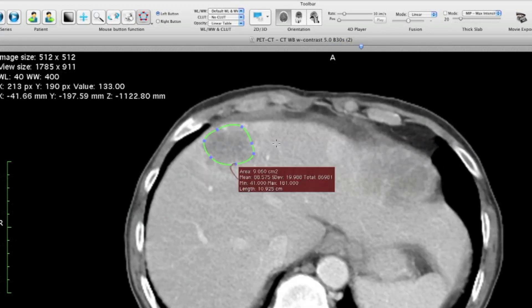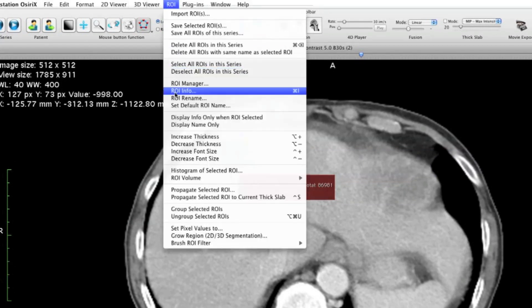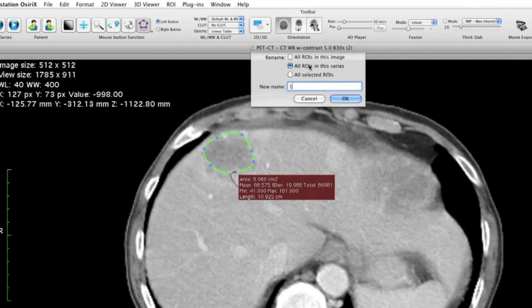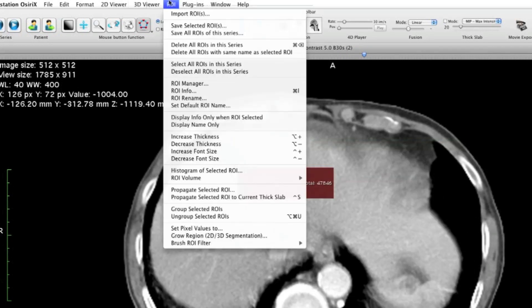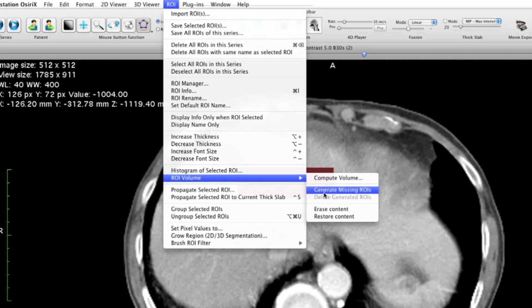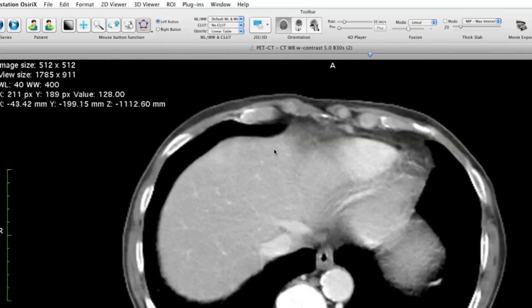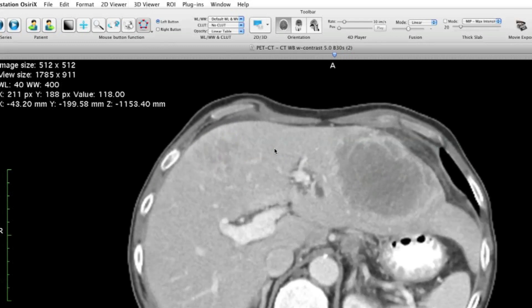Once you have drawn them, you need to rename all the ROIs because they currently have no name. Go to ROI > Rename, select all ROIs in the series, and give them a name — it doesn't matter what name, for example "222". Then go to ROI > ROI Volume > Generate Missing ROIs and click on it. If it worked, you will see ROIs appear in every slice.